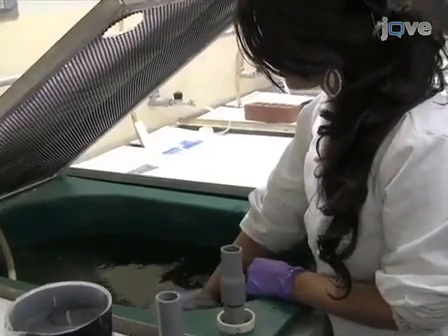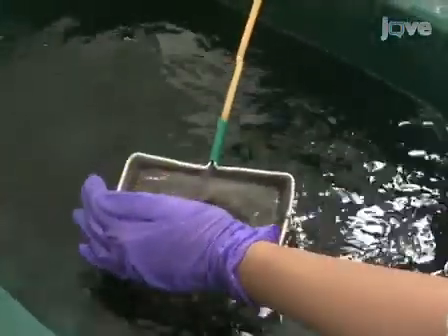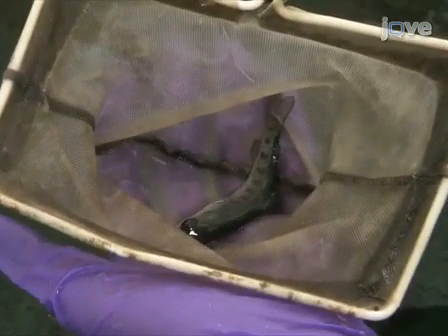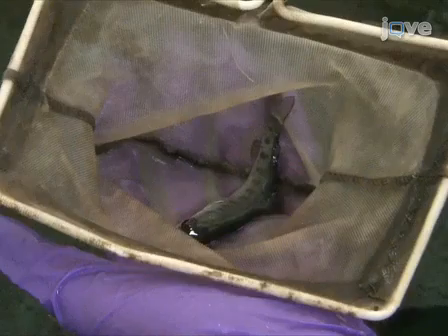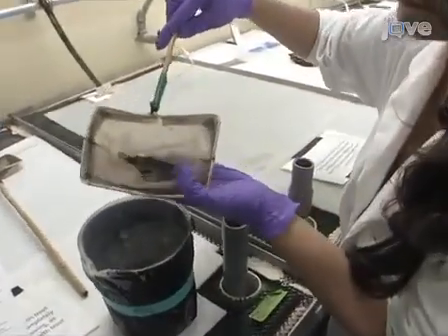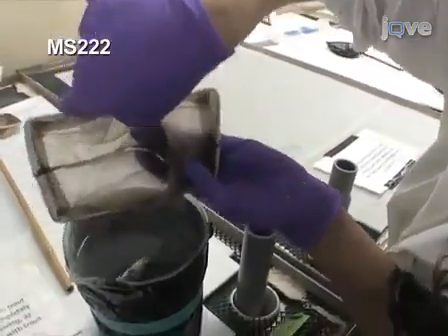Using a knotless net, collect individual fish from their holding tank. Minimize capture time, avoid collecting multiple fish, and do not hold fish for more than a few seconds in the net, as these factors can increase stress, and stress can affect swimming performance. Place fish in a freshwater transfer tank containing tricaine methane sulfonate anesthesia buffered with sodium bicarbonate.